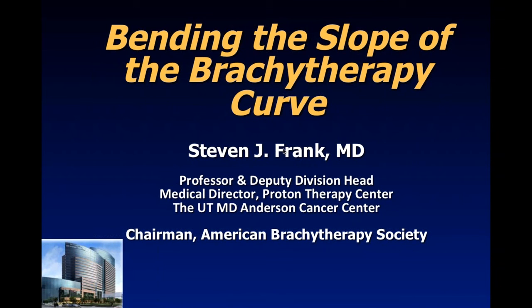I think you need to buy a couple phantoms. We're looking at ways to do that through some novel technology that can allow for you to take your MRI for that particular patient, and then have a model made up of that particular prostate, and then practice on it before you go to the operating room. So there's a lot more technology that's coming out today.